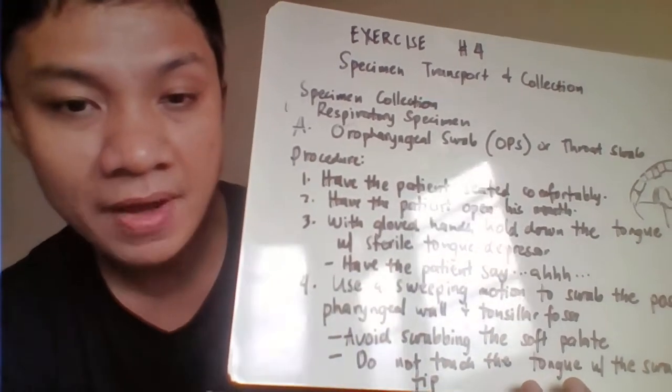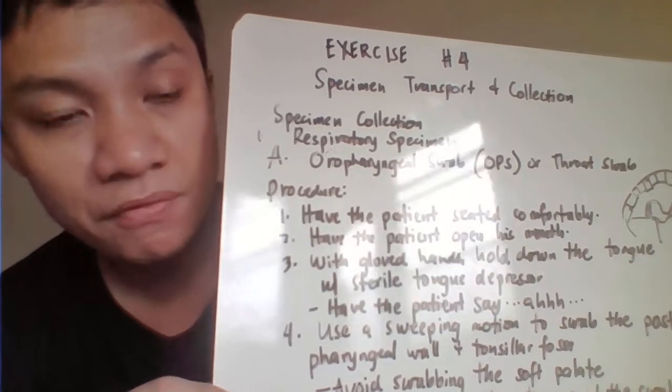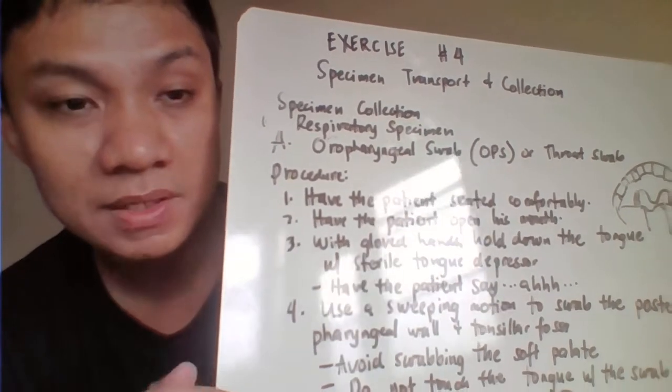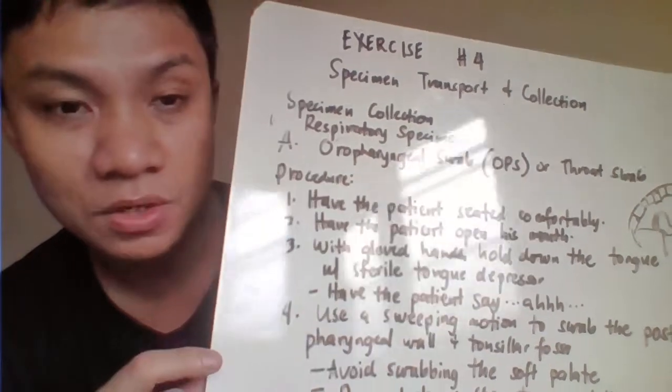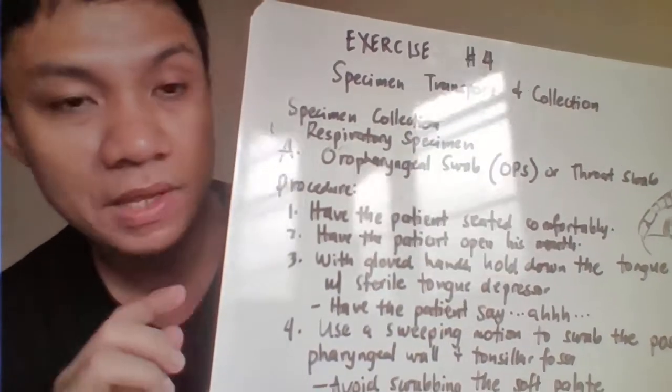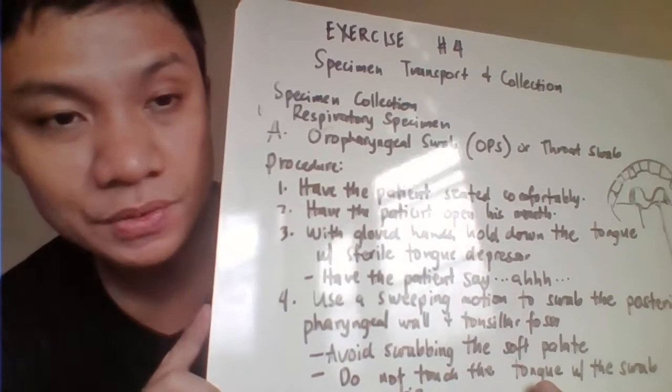So in the laboratory manual, you have several methods for the specimen collection procedure, even those that were discussed in our lecture. But for our lab, we'll be concentrating on two respiratory specimen collection procedures.